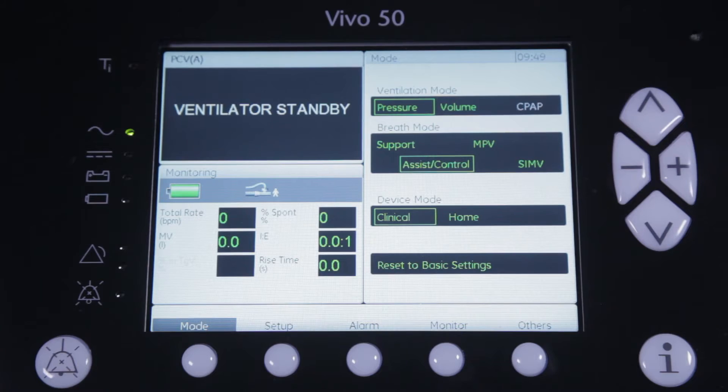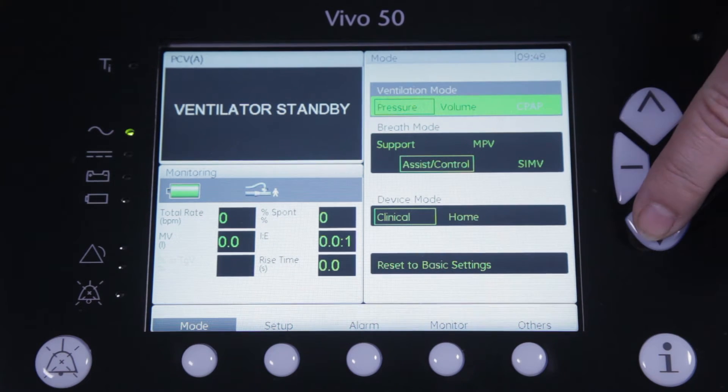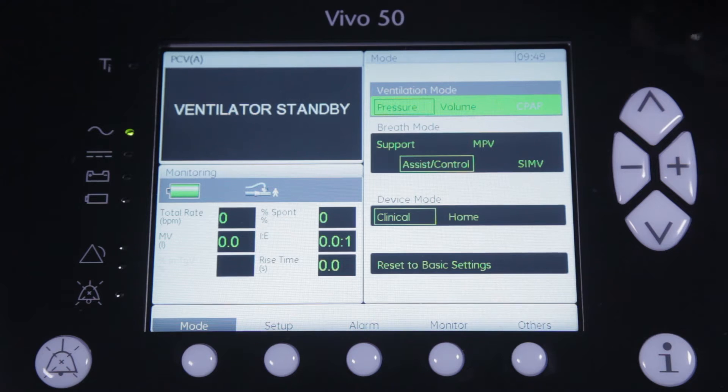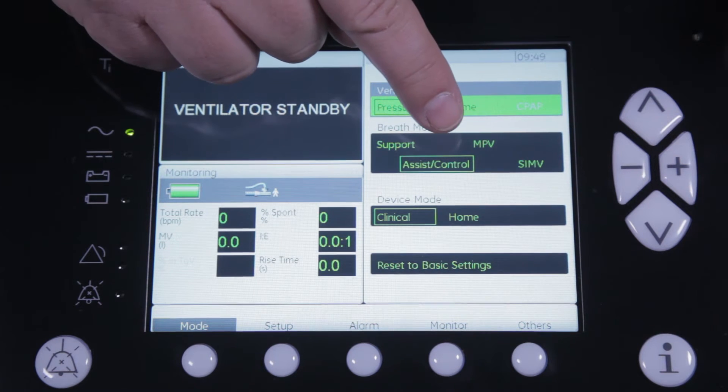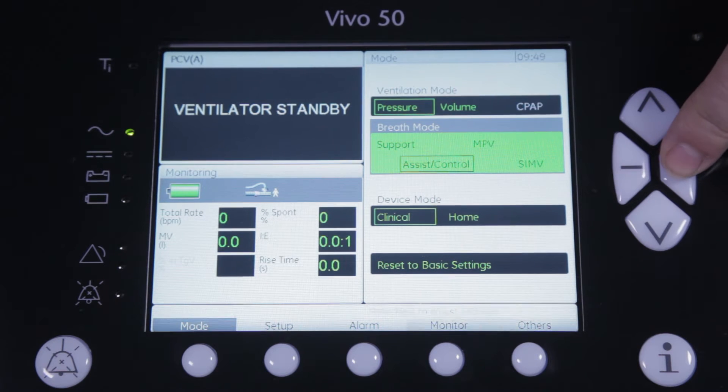To start, we go to the mode section of the ventilator and select pressure as our ventilation mode. As you can see, MPV has now been added as a dedicated breath mode, so you just have to highlight and select it to start the configuration.